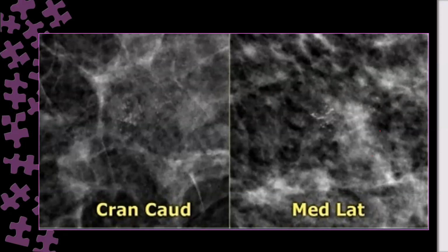If it is not going in segmental distribution, and if it is not going in triangular pointing toward the nipple, say it regional. If it is pointing, you can say segmental. If it is going to the line, say linear. If it's taking the whole breast, say diffuse. Diffuse, but not like the previous case.